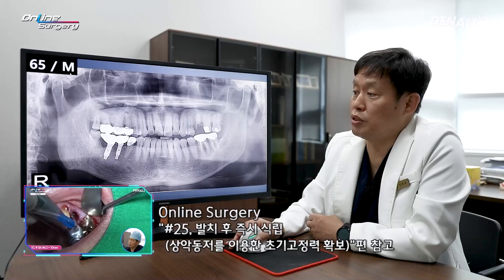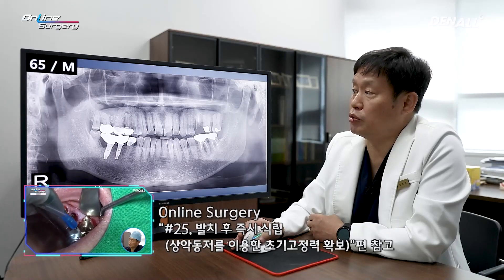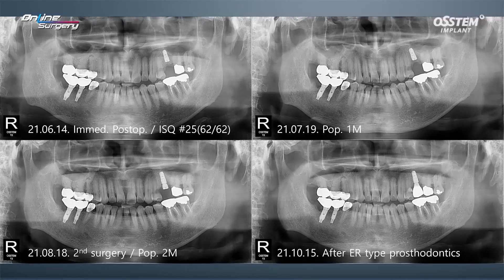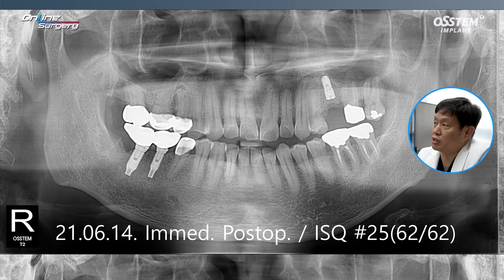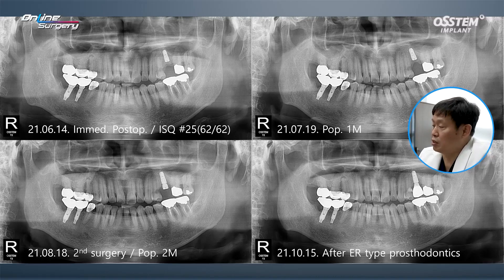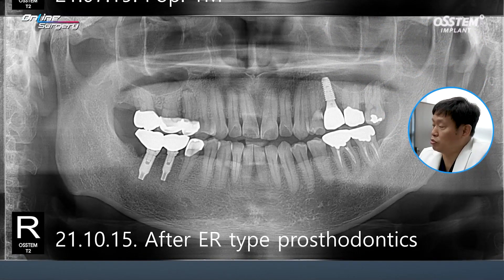At the time, if you take a look over here, this initial visit in April 2021 — in number 25, the tooth was fractured. In June, I removed the root rest, and using the sinus floor, immediate implant placement was done. There was a 2mm gap with the buccal wall. Sure-OS was used to do socket graft. You can see that the final prosthesis was delivered in October 2021.